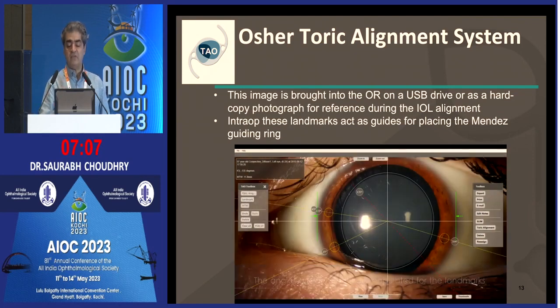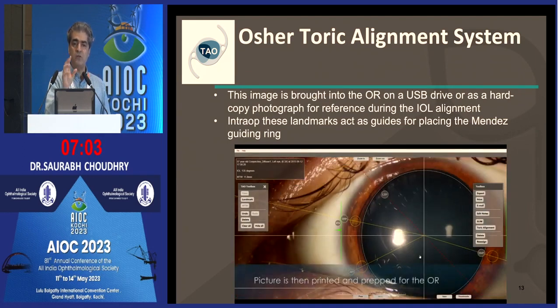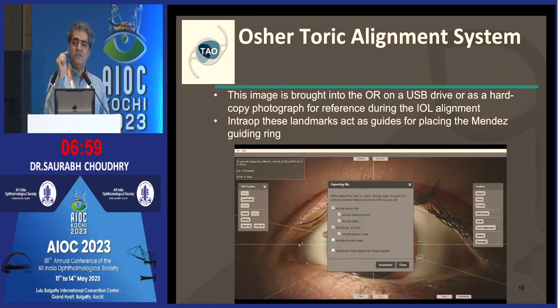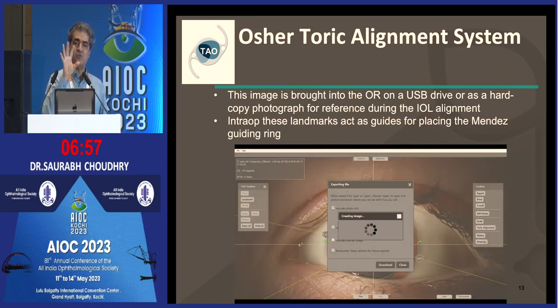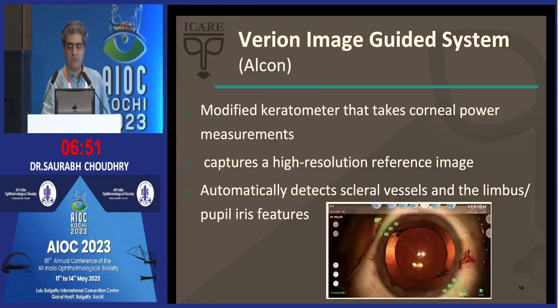So once it is aligned, you actually know, with the patient in the sitting position, or let's forget about sitting position, we've actually come to know where exactly these are, and whatever the intorsion or extorsion takes place, it is not based on the 0, 180, but it is exactly based on the way the crypts are. So it becomes more successful.